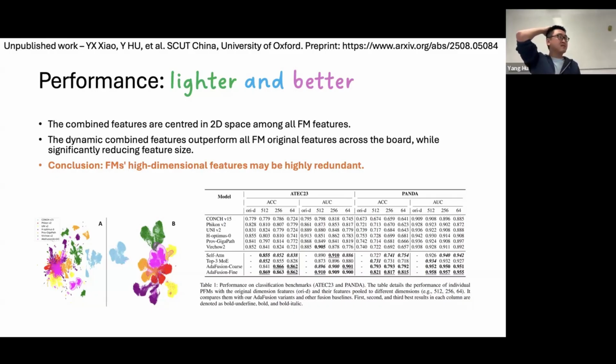I guess there's those things called LoRAs, which are a great way of taking a generalist model and tweaking it in some particular direction. It might be a cool thing to have a big generalist foundation model and then train a bunch of LoRAs for each specific disease, and you just learn the LoRA for the disease you're looking at, and then you suddenly have a model which is tuned.